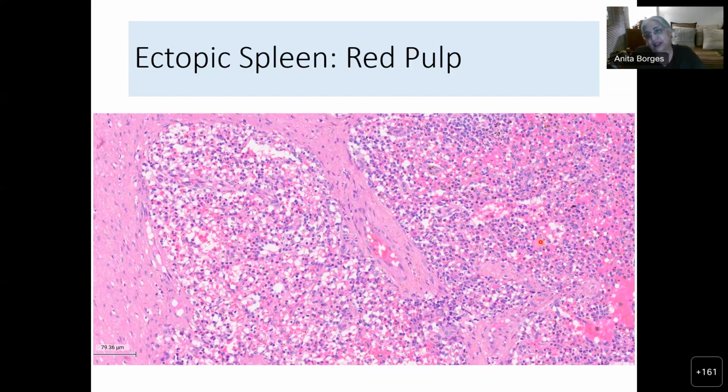Because that is part of the spleen which reacts to antigen, just like the mantle zone does, but this is in the spleen, it is a T-independent reaction. Whereas in the mantle zone of the lymph node, that is a T-dependent reaction, okay? You start to get the formation of germinal centers where you have long-lasting antibodies, etc., being formed. That's not the same thing. Well, why do I say then that it is like the mantle zone? Well, it expresses IgD.